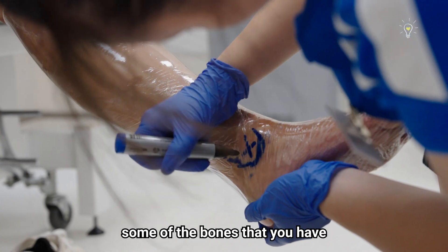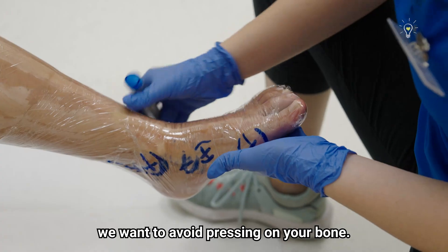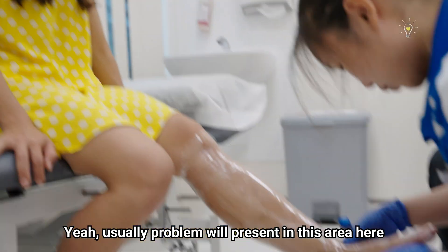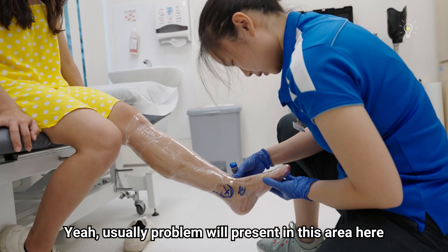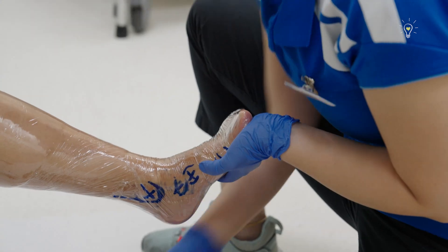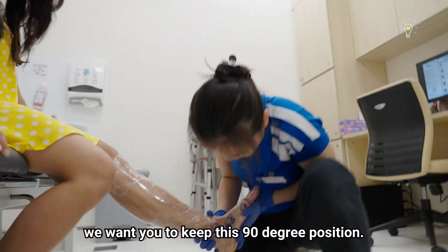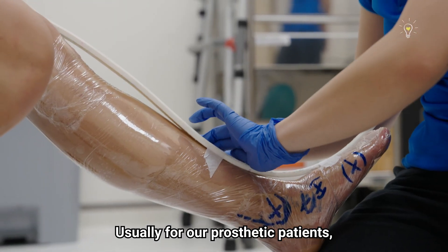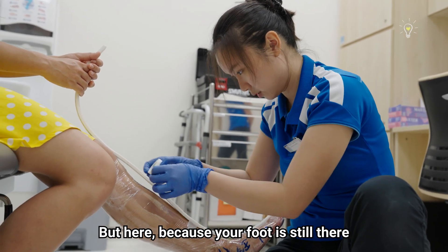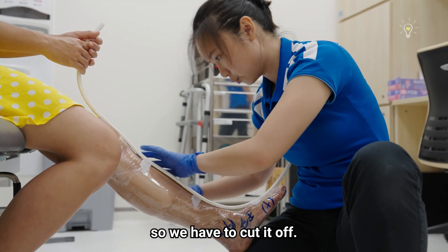So now I'm just going to mark out some of the bones, because in the device you're making, you want to avoid pressing on your bone. Usually problems present in this area because a lot of shoes are very skinny to look fashionable. Usually in casting, we want you to keep this 90-degree position. For prosthetic patients, it's easy to slide the cast off, but because your foot's still there, we have to cut it off.